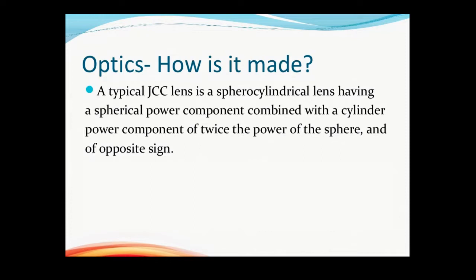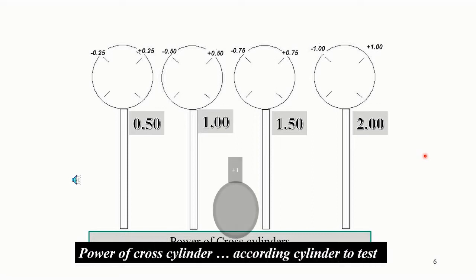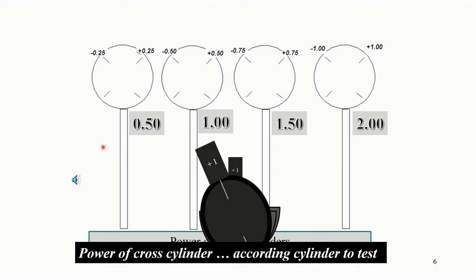So a typical Jackson cross-cylinder lens is a spherocylindrical lens having a spherical power component combined with a cylinder power component of twice the power of the sphere and of opposite sign. Cross cylinders can be of different powers, varying from half, which is formed of two cylinders each of 1/4, to 1, 1.5, 2. The power of the cross cylinder used varies according to the cylinder we are testing on the trial. For example, if the power of the cylinder tested is small, we go for a small cross cylinder, and if it's high, we go for a high power cross cylinder.